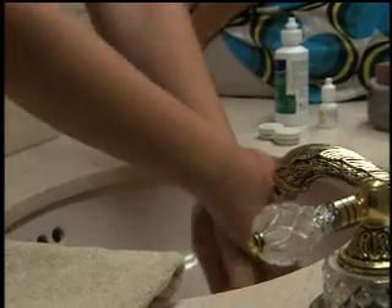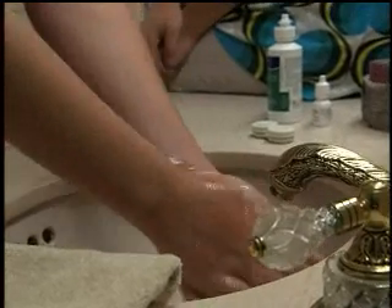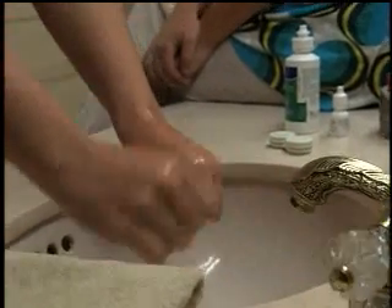This is Jordan. She's a new AccuVue brand contact lens wearer like you, and she's going to demonstrate how to insert or apply your contact lenses. But before she does, she needs to do something very important. Whenever you touch your lenses, you always need to first wash your hands and dry them on a clean, lint-free towel.